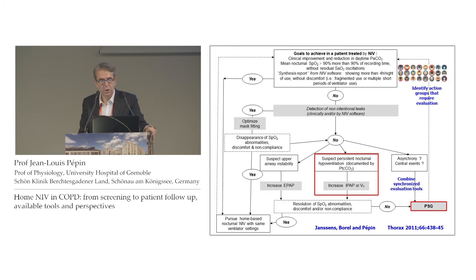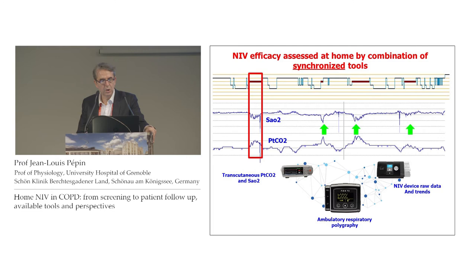And this is just a clinical example. As you can see, this COPD patient under non-invasive ventilation has persistent hypoventilation during REM sleep. You can see that even during a very limited episode of REM sleep, you have a huge desaturation and a concomitant increase in transcutaneous PCO2.